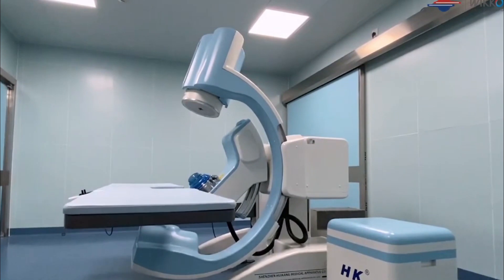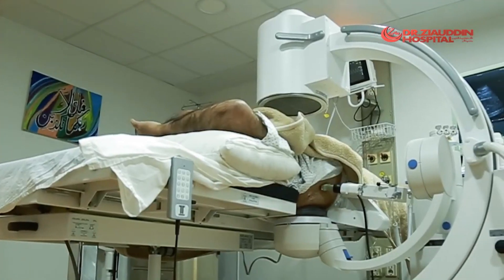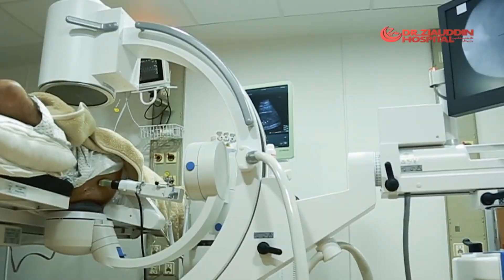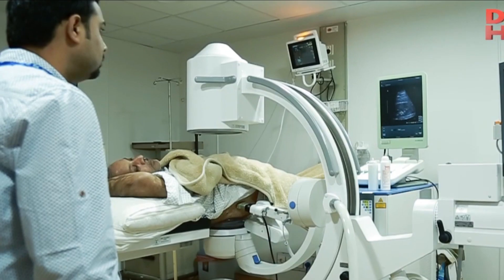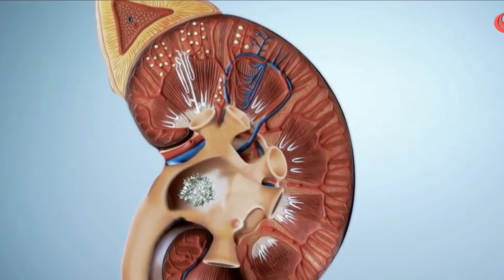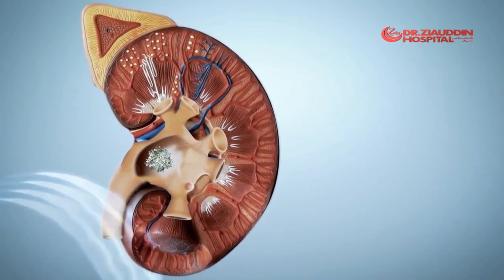The last component of the lithotripsy machine is the localization system. Imaging systems are used to localize the stone, direct the shock waves onto the calculus, track the progress of treatment, and make alterations as the stone fragments. The two methods commonly used to localize stones include fluoroscopy and ultrasonography.